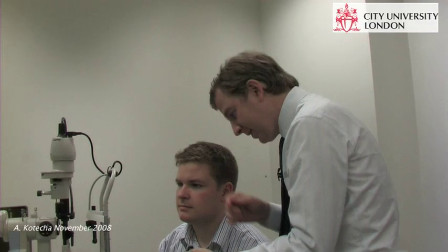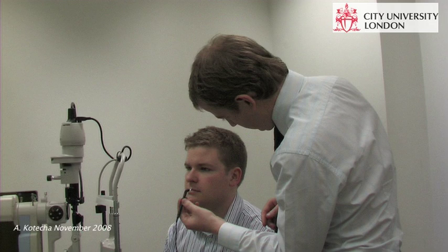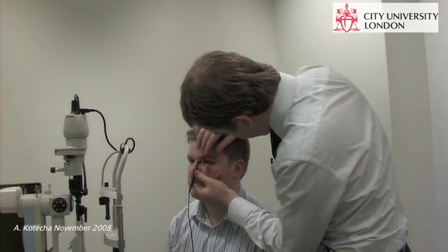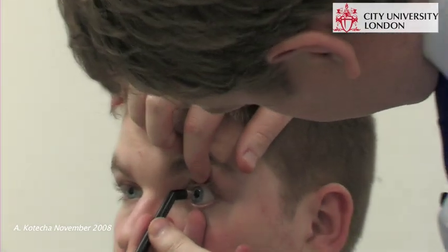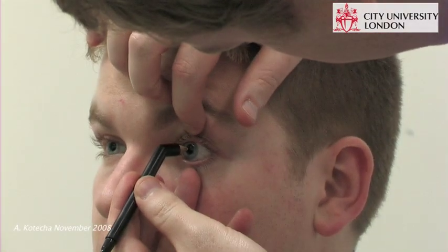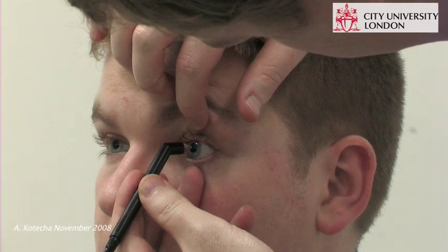Now if you could just look at the letter A over there, and I'm just going to hold your lids. Well done. Thank you.